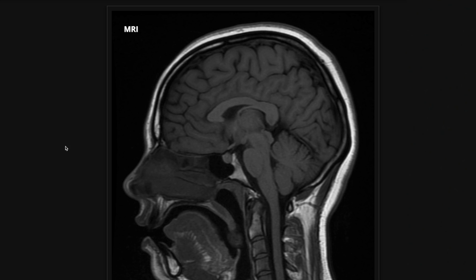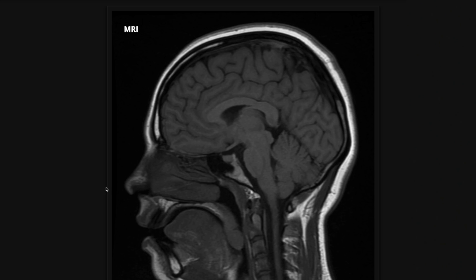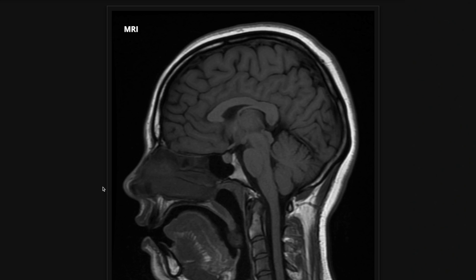Another good thing to look at on the sagittal T1 is the bones. You can see the calvarium here, and you can also see a lot of the cervical spine down here. On T1, you're looking for things that are dark within the bones — hypo-intensity within the bones can indicate pathology. So when you're done looking at all the midline structures, remember to look at the bones when you're on your T1.